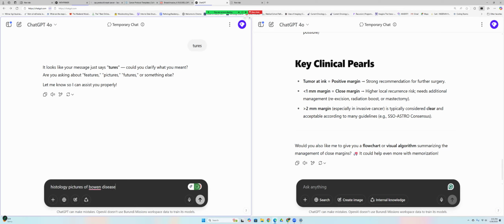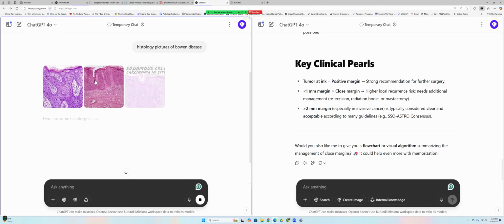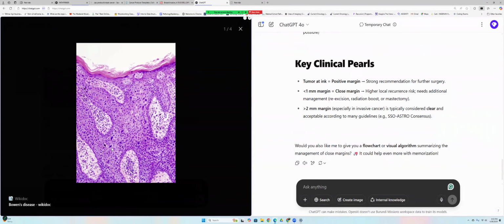You know that everything occurs in the epithelium, so it may mimic Paget disease in the epidermis. How do we differentiate Bowen disease from invasive carcinoma of the skin? That's the differentiation from Paget disease on H&E. If you're looking at how you know this is not invasive squamous cell carcinoma of the skin but Bowen disease, it's still in situ. It's not yet invasive cancer.